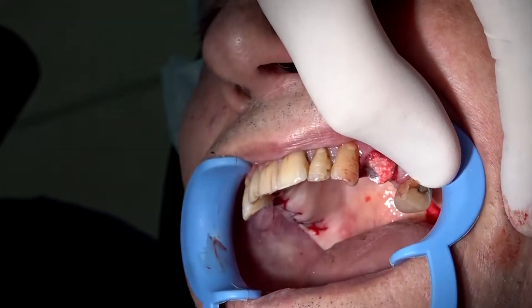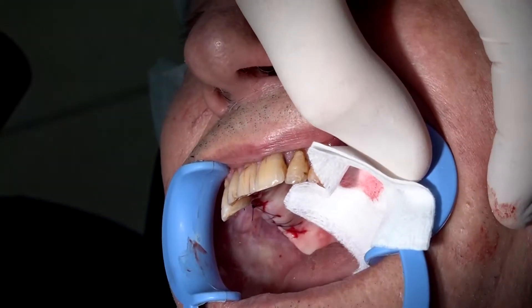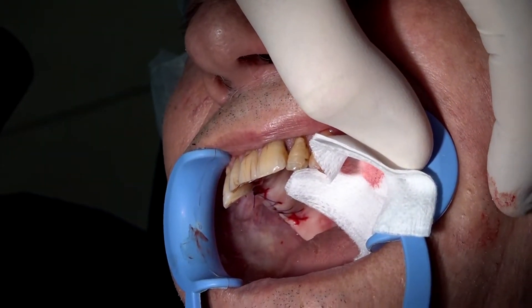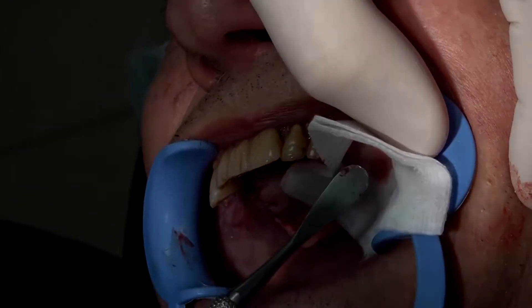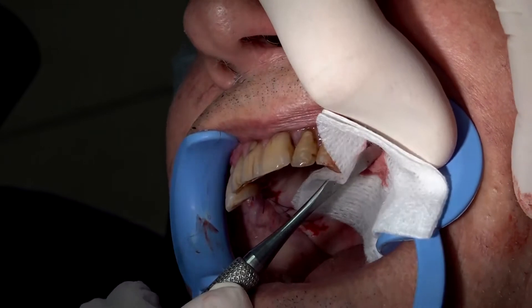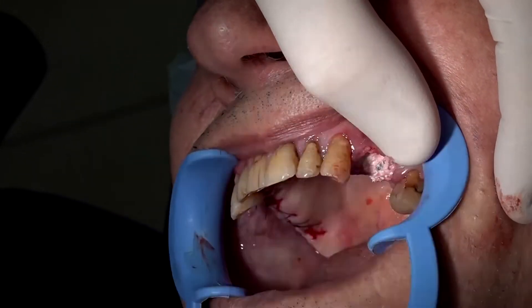It is important to take a dry gauze and to press strongly, first with the finger, then with a periostal elevator. The material must be well compacted in the cervical zone. It is extremely important.